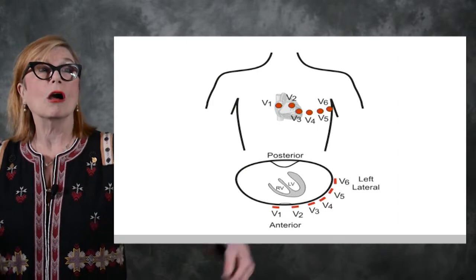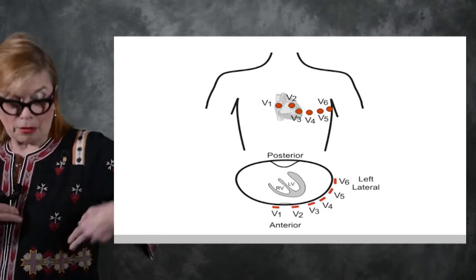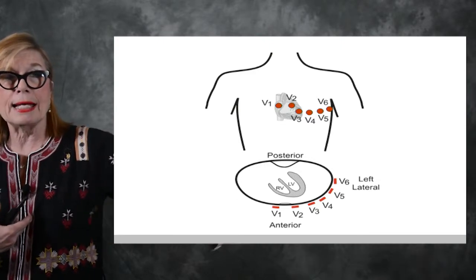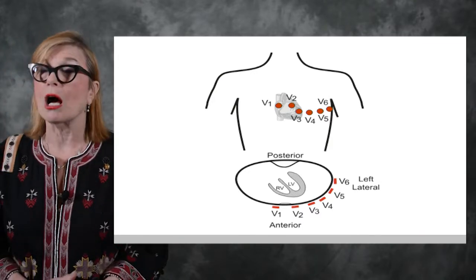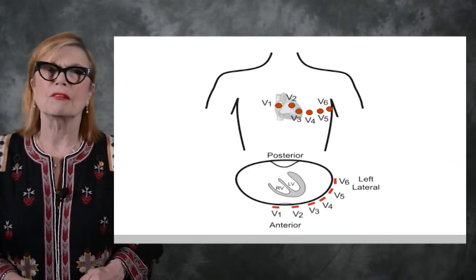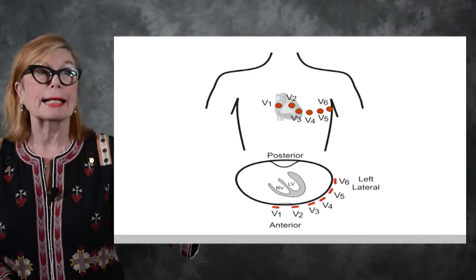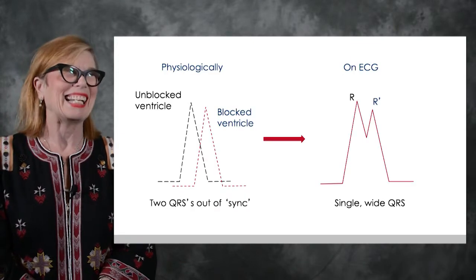We're looking at the heart from two directly opposite sides, the right side and the left side, so that I can look at the mirror image of electrical conduction in the heart. More about that later, but it's very important. What I see on one side, I should see the exact opposite on the other. And that's what I always look at when I see an EKG.